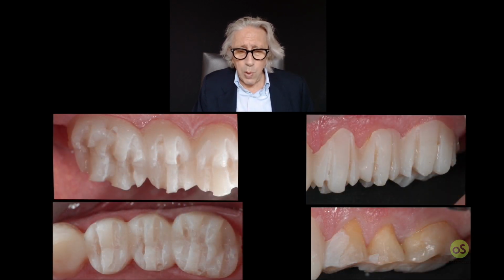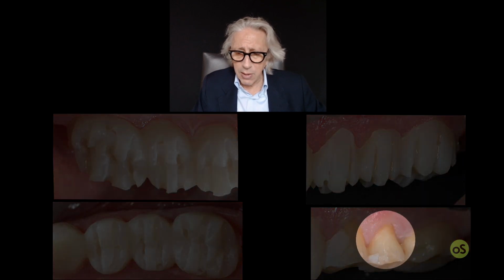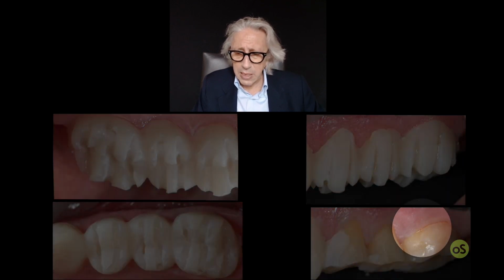So once you prepare the back with the normal thickness, with the calibrated reduction, you have to take into account that we need to know what kind of material we select after that. So if you want a material that is able to have 5/10 of a millimeter, or 8/10 of a millimeter, or 1 millimeter, according to that, once you cut back and remove the mock-up, you see that the teeth were not touched at all. It means that we can really save all the enamel that is still present there.